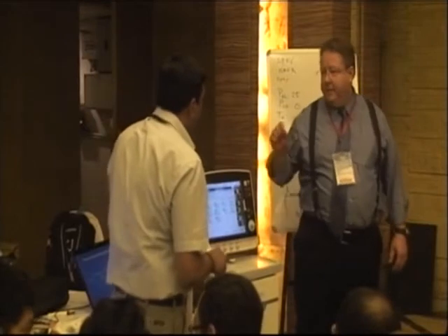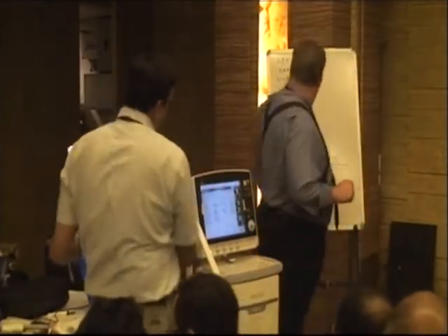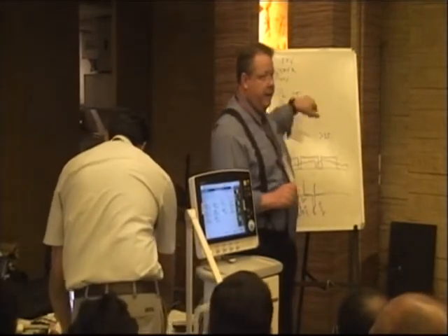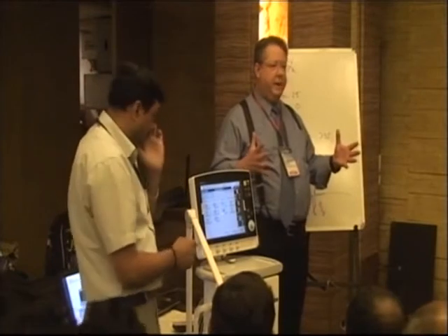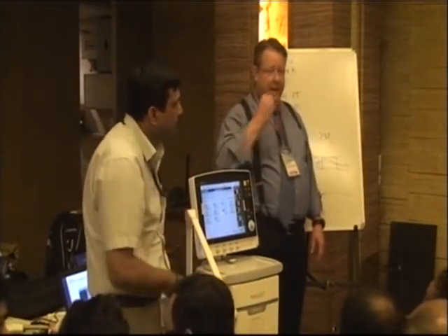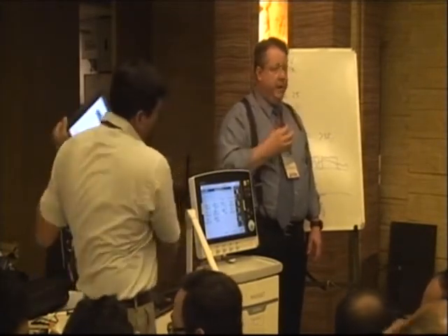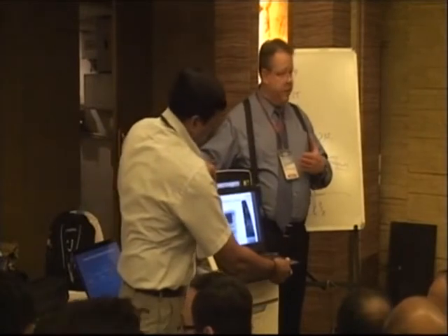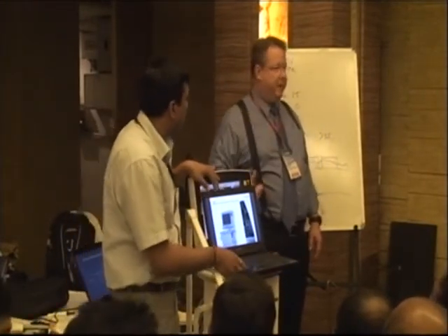Okay. NAVA. We want to talk about neurally adjusted ventilator assist, NAVA. It's a new mode. It is not being used across the country by any means in the United States. It's mostly being studied. When we think about how we let people spontaneously breathe, it's flow triggered, back at the machine in most machines. So this is one mode that allows us to trigger based on the diaphragm activity.